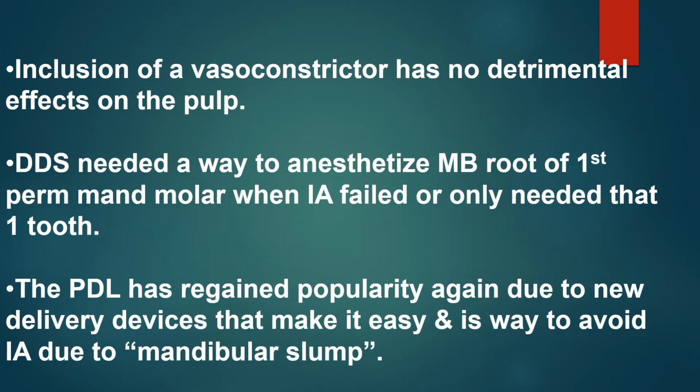But now that they've made these new devices, it's gained popularity again because it's very easy, and it's a way to avoid doing the IA, and a way for these dentists to avoid that mandibular slump that so many claim happens at least once or twice in their career.